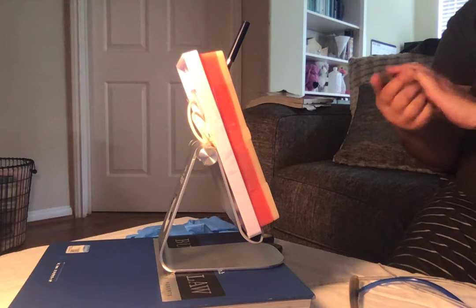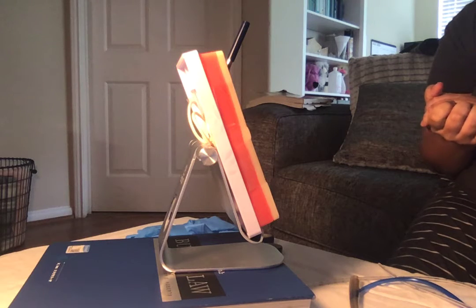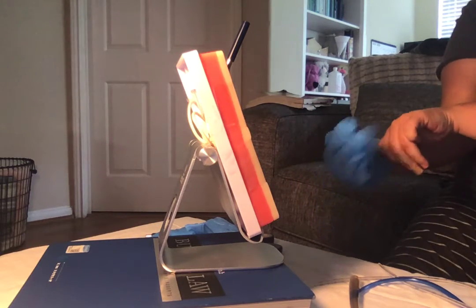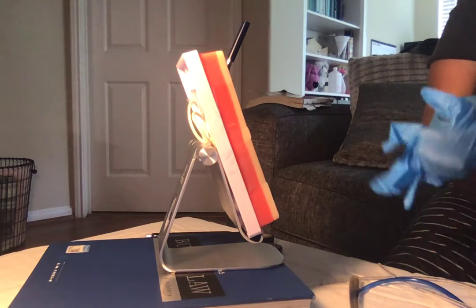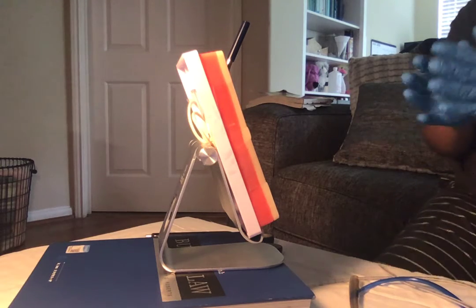I'm going to perform hand hygiene. I'm going to identify the patient with 2 identifiers, and I'm going to explain what the procedure is today. I'm going to put on clean gloves and prepare supplies. I am then going to place a pulse oximeter and monitor and measure the patient's vital signs.